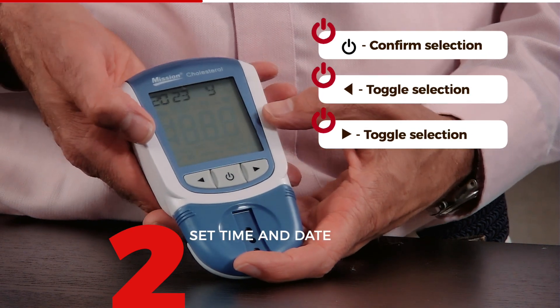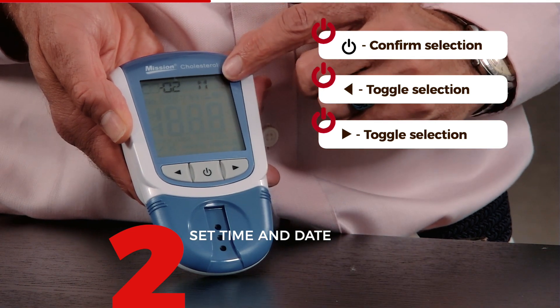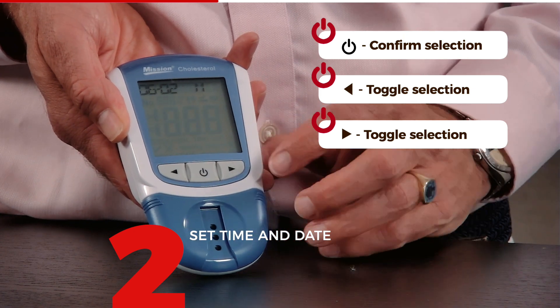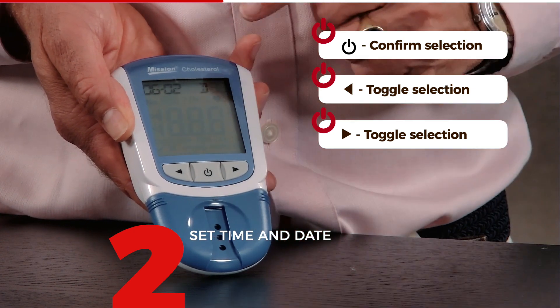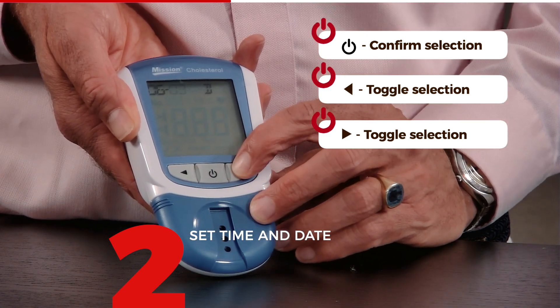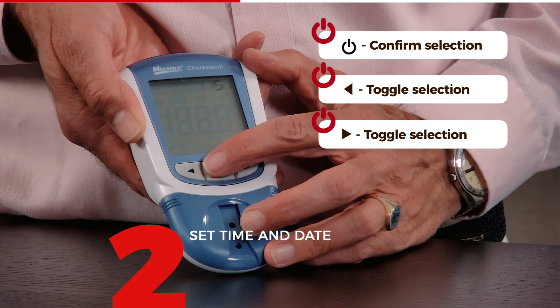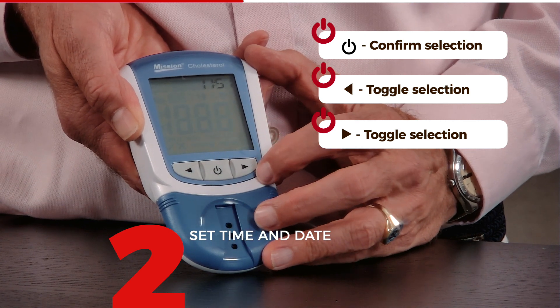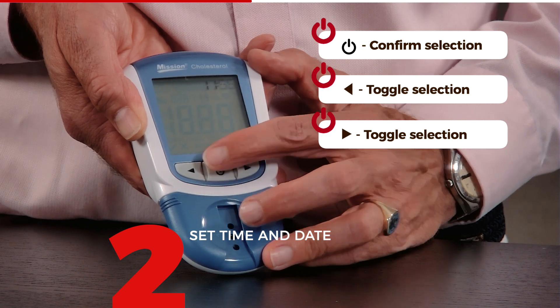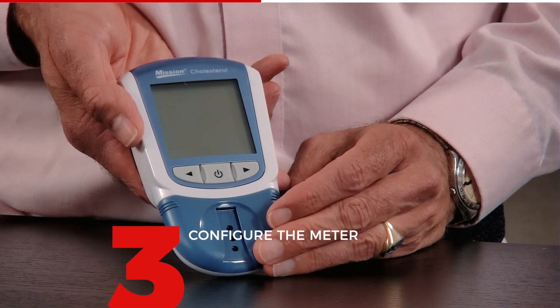Step one: choose the year. I press confirm for the year. I now get the month — you can see the M for month. It is actually June, so I'll change it to June and confirm by pressing the center. I now see D for day, and it's actually the 25th, so I press confirm. I now get the time — the hours. I confirm, and I can set the minutes to 11:55 and press confirm. The date and time are now set.